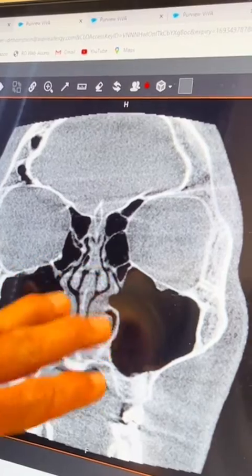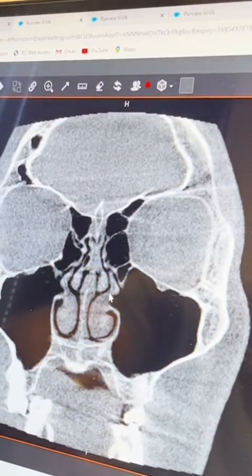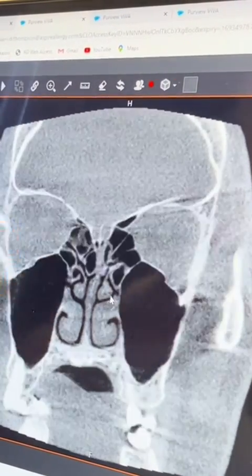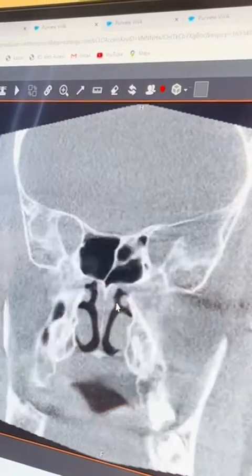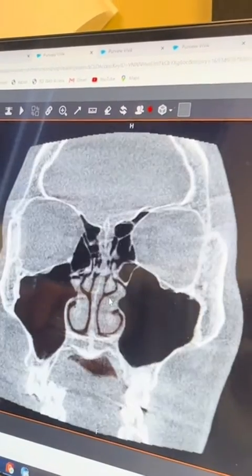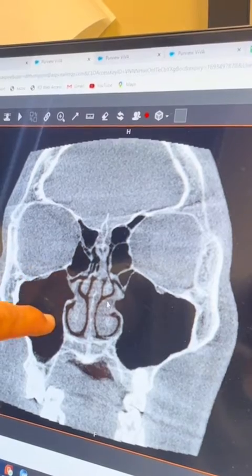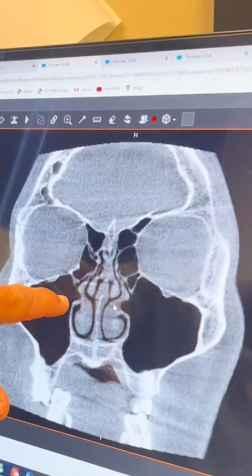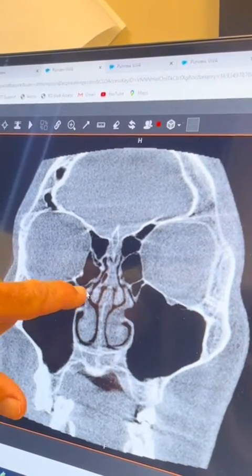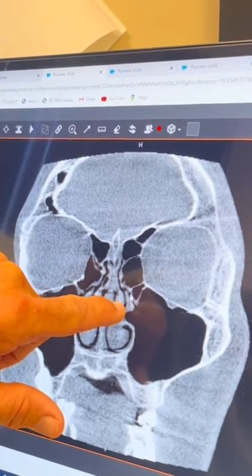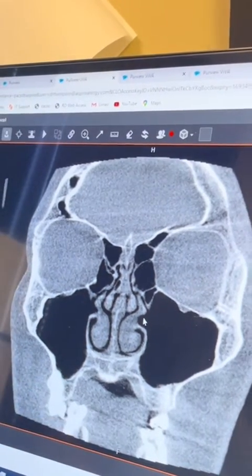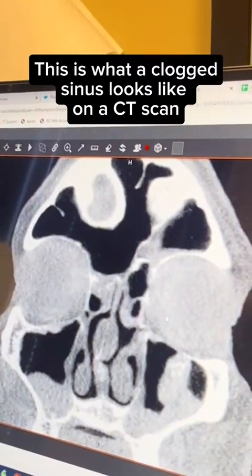We're seeing air, which is black, in the sinuses. We don't see any gray, and we can scroll through to get from front to back for a full 3D evaluation of his sinuses — and again we're seeing black air. His drainage pathways out of the sinuses are right here and here.